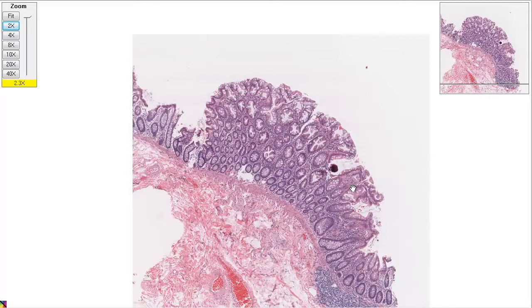A common response of the body to irritation is some sort of change. Like we were saying before, epithelium is the top layer, so it's facing the outside world. If it's irritated, often the epithelium will change, and in this case, it's changing by undergoing more growth. Even if it's non-cancerous, is there a higher likelihood that it's going to become cancerous in the future?